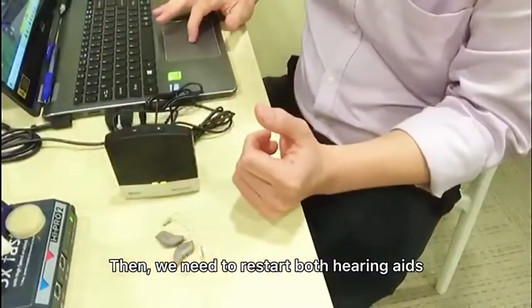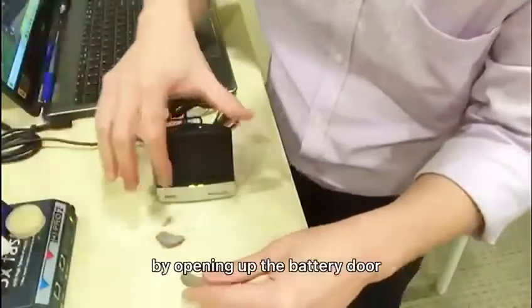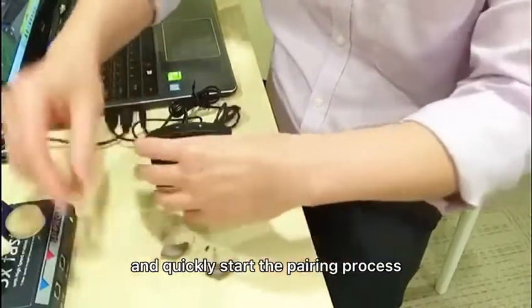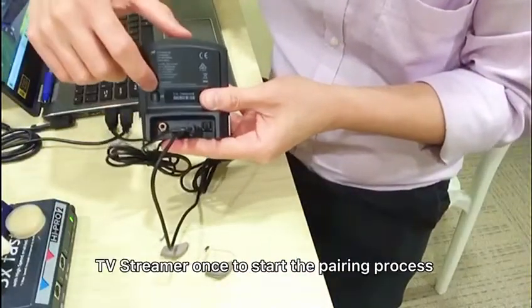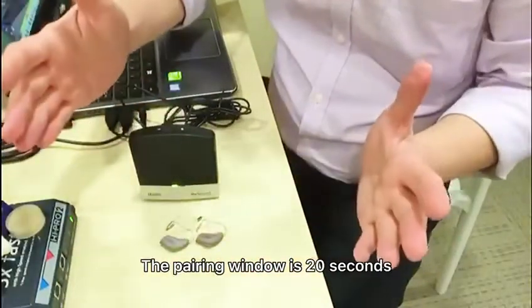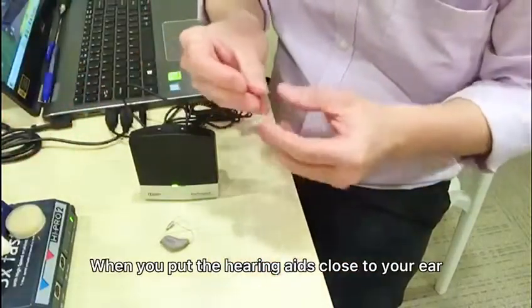Next, restart both hearing aids by opening up the battery door and closing the battery door, then quickly start the pairing process by pressing the back panel of the TV Streamer once. The pairing window is 20 seconds, so you have to complete the pairing within these 20 seconds.